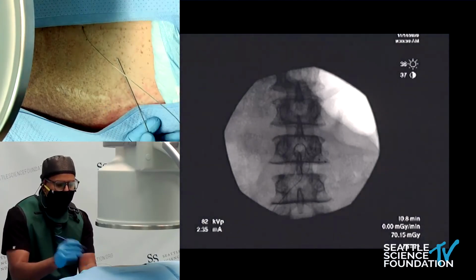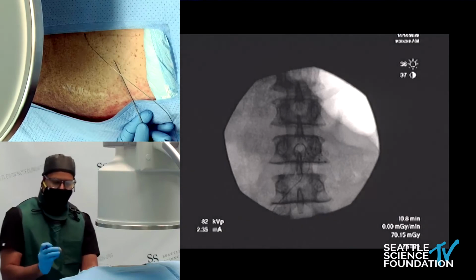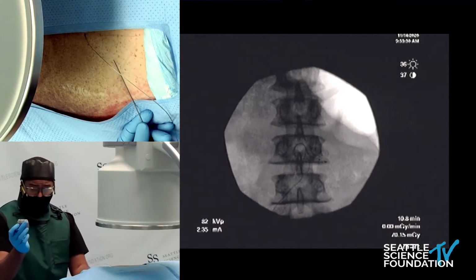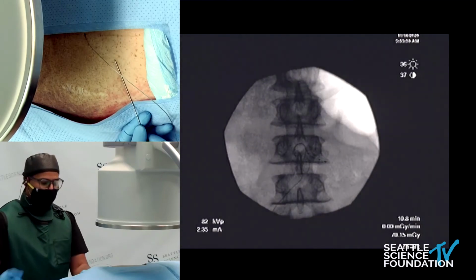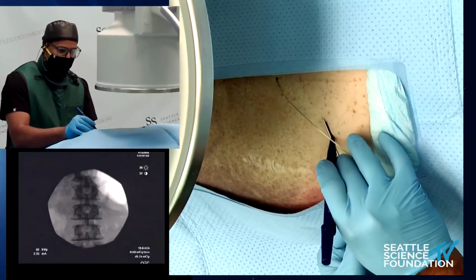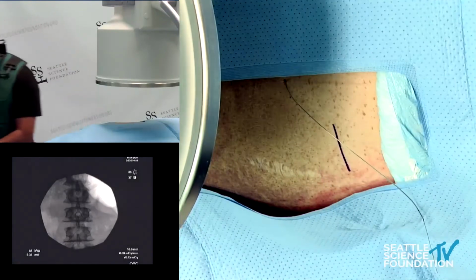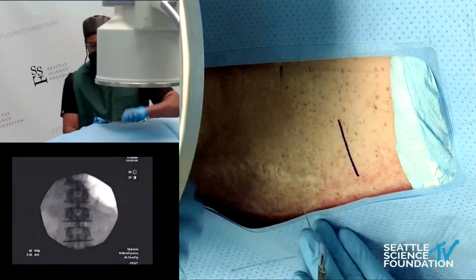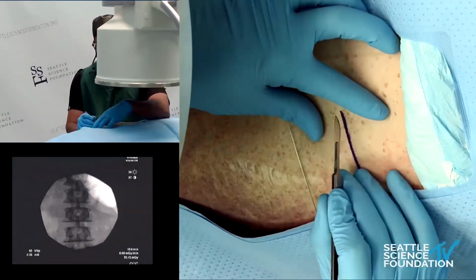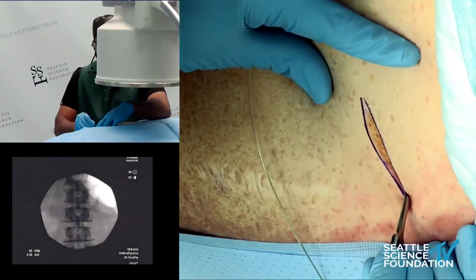I'm following them perfectly. And for this particular system, the Abbott Proclaim, I follow the interface between basically the plastic silicone and the metal, which is about 4 centimeters, and I draw a line, so like so. And of course, I'd use local anesthesia. I start with the 27 gauge and then follow with the 22 as soon as the skin and subcutaneous tissue is well anesthetized. Hold some pressure, retraction, and then incise firmly.